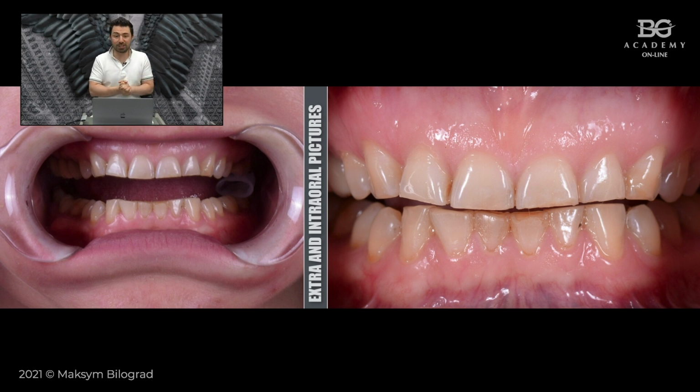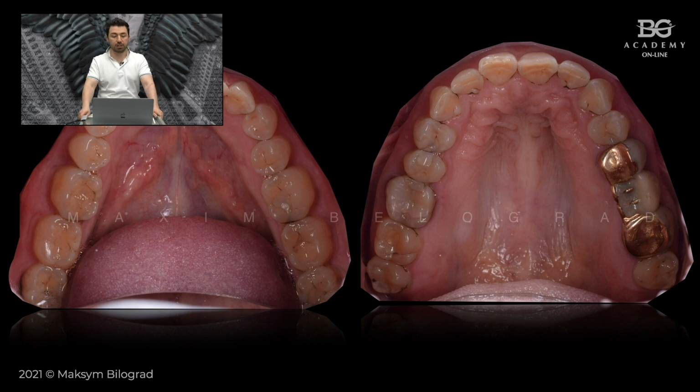Because the last case that we presented recently was also touching partial restoration for posterior teeth, and we got a lot of questions and requests to show you a little bit more from a clinical perspective different types of restorations, especially when people started to download our PDF file, which is Atlas of Posterior Preparations. And today you will see some different types of restorations for posterior teeth that may be helpful for your daily basis. So let's continue.